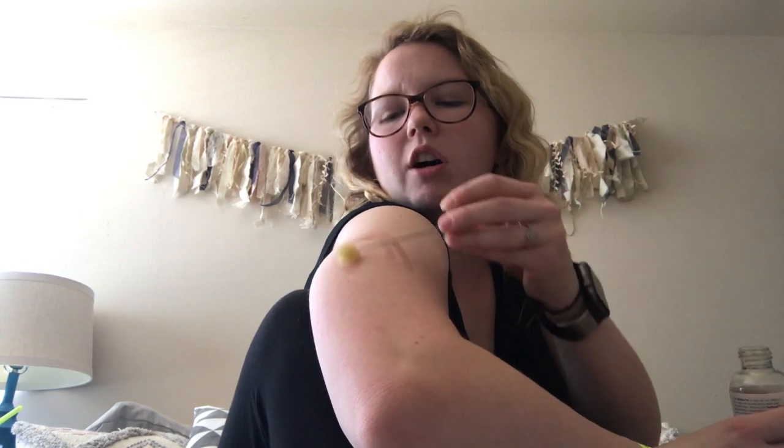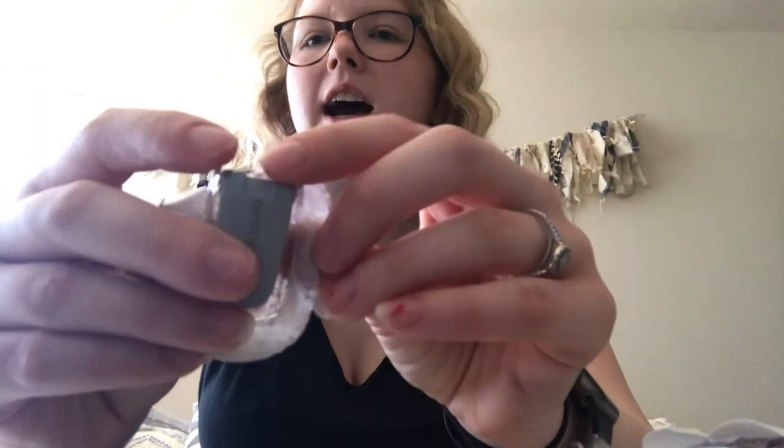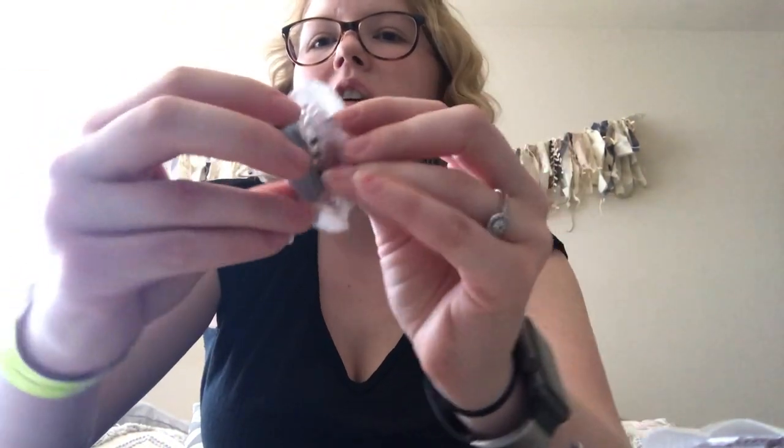I always put my CGM in my arm because I already have the insulin pump on my stomach. Just like the alcohol prep, I'll rub the Skin Tac all around my arm where I think I might put it. It's going to take a minute to get tacky — I don't want it dry but I don't want it wet, just tacky. So I'm going to take the old inserter apart — it has little tabs and I pull them apart and that pops it up.